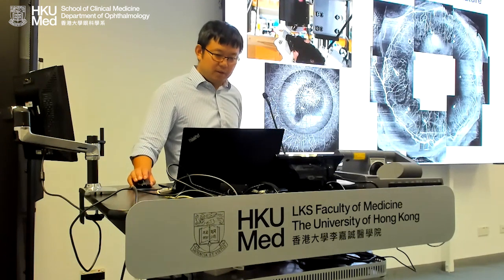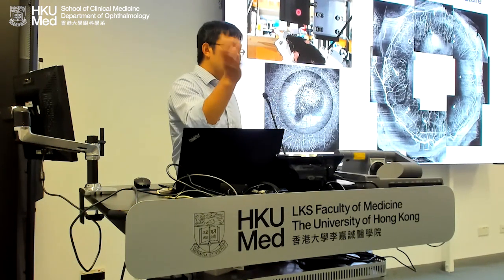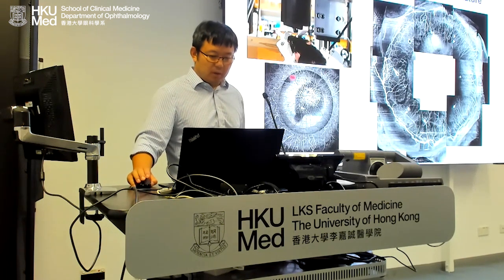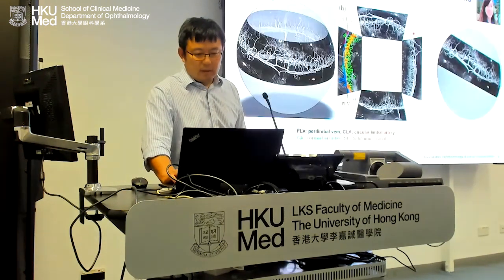Because we build OCT, in our small animal OCT we mount a circular motor and just rotate it. And this is the rotated OCT angiogram. And this is the Schlemm's canal. Now you see that, right? It's a circular structure. At the time, we had to manually stitch them, which is fine. As a proof of principle, all these are acceptable.